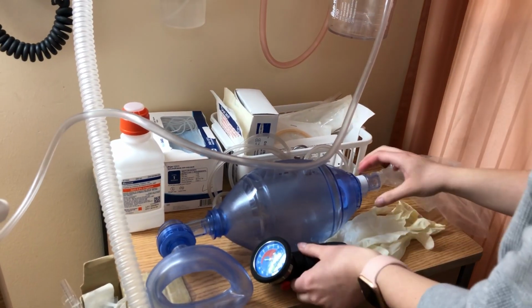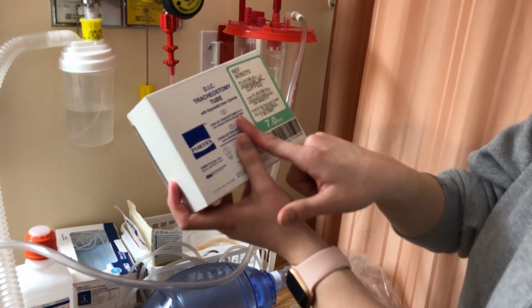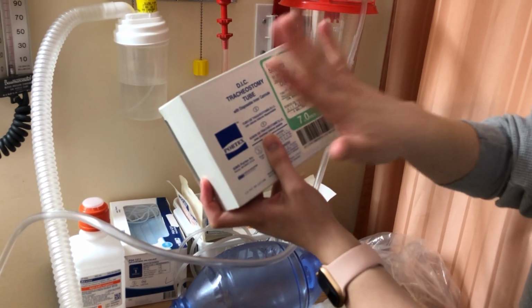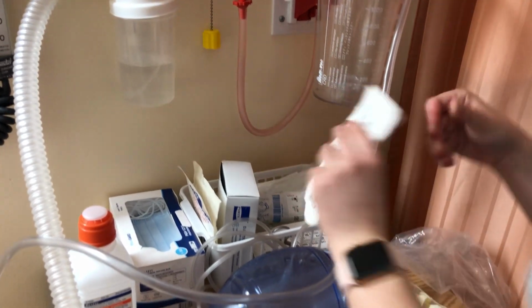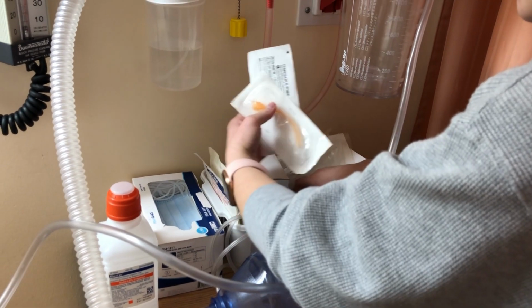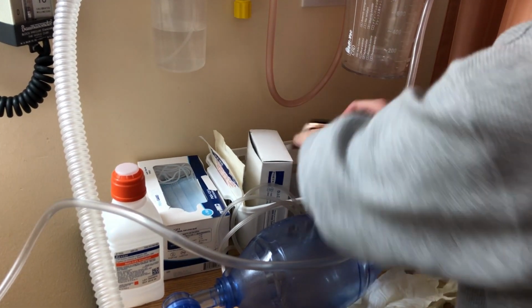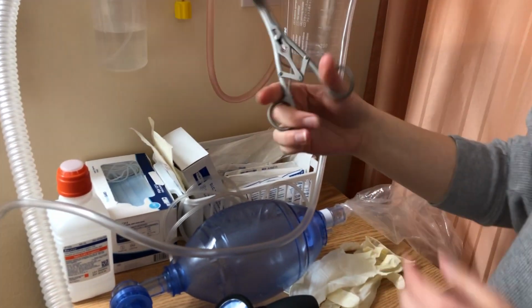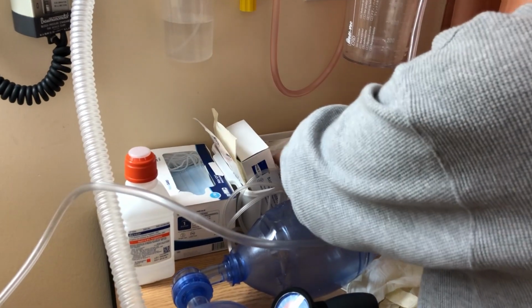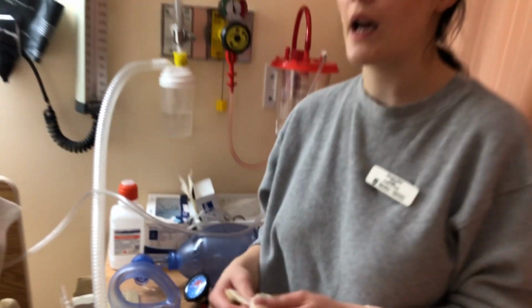I'm gonna be checking the cuff pressure. I'm going to make sure that we have another trach. So my trach was a size 7, so I have a size 7 here, just in case anything were to happen. A replacement inner cannula. So we have replacement inner cannula, extra trach ties, extra gauze, and the dilators, okay, in case of an emergency. All right, so before I check cuff pressure, I have to suction the patient.